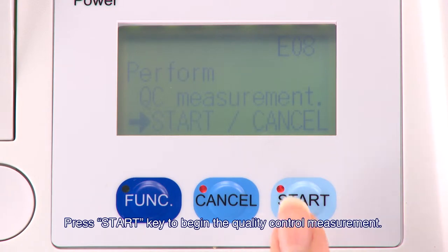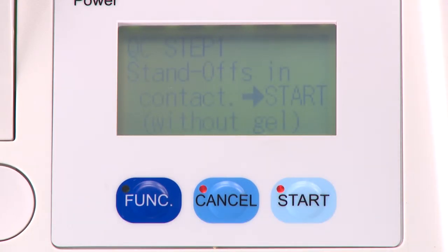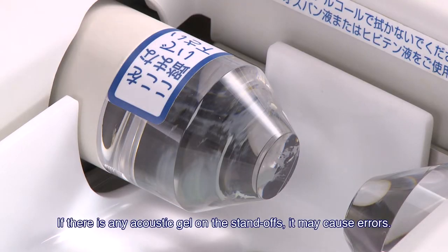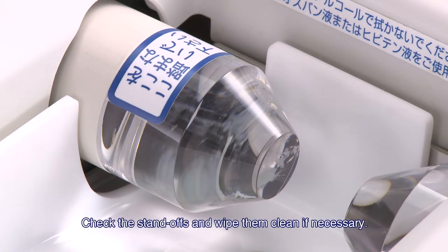Press the start key to begin the quality control measurement. The QC measurement step 1 screen is displayed. If there is any acoustic gel on the standoff, it may cause errors. Check the standoffs and wipe them clean if necessary.